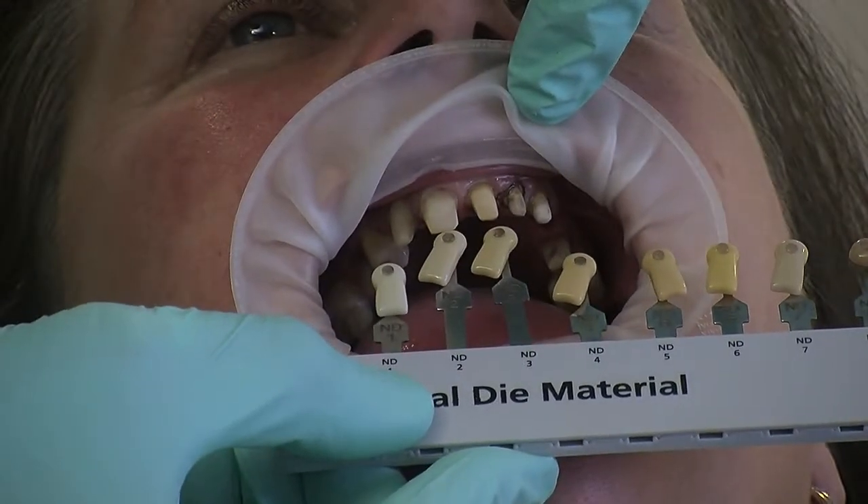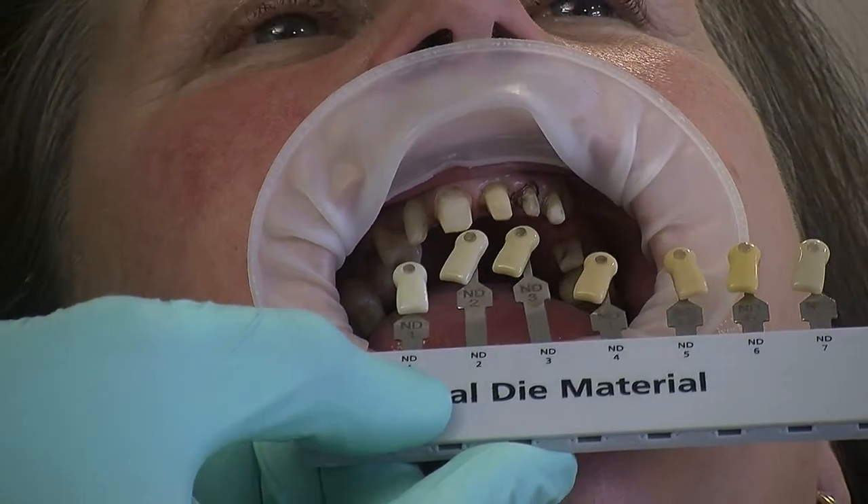So these are the colours I'm going to hold here. Then I'll take some digital photographs as well.